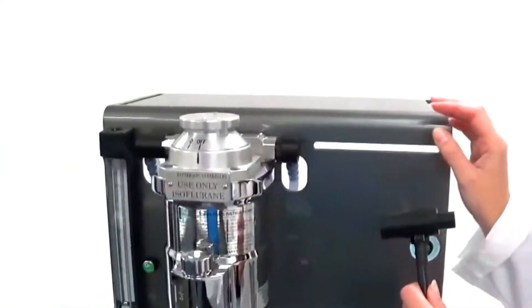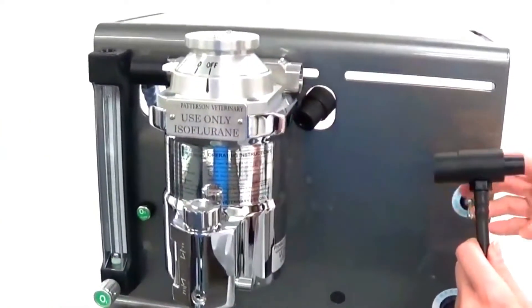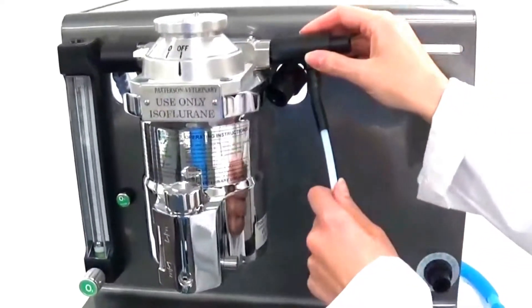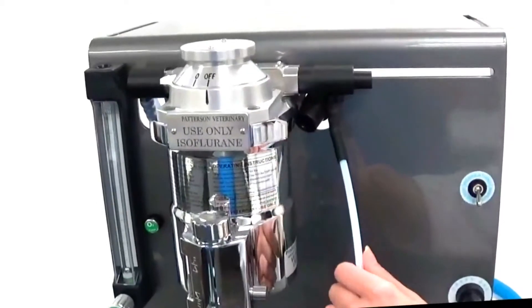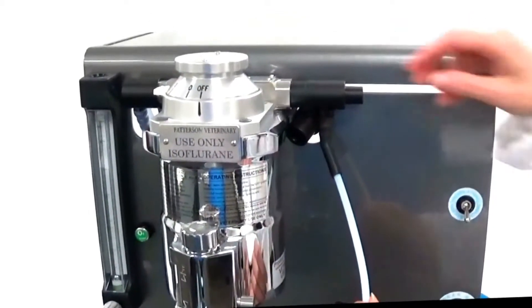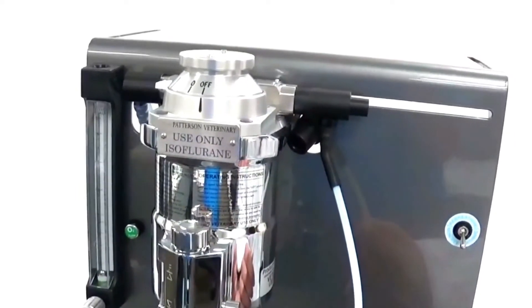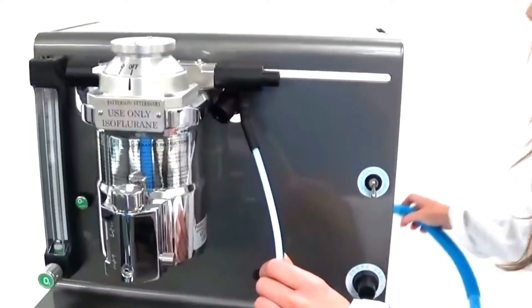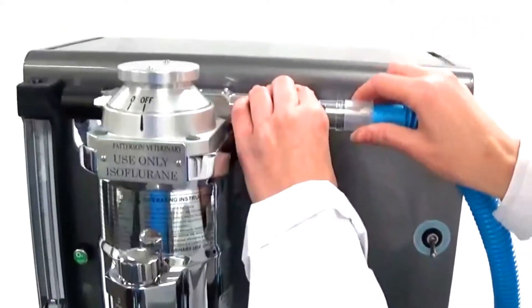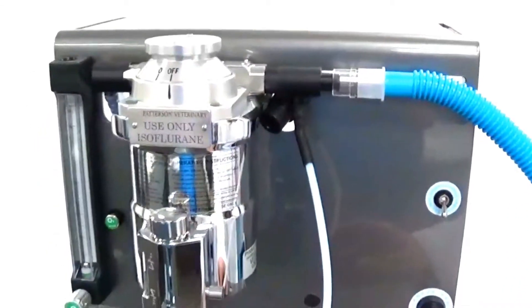Next, we need to remove the male end cap from the outlet side of the vaporizer and attach the gas sampling tee. Make sure the tee is snug inside the manifold to keep any anesthetic gases from escaping. Then we will attach the 19-millimeter tube to the 15-millimeter side of the gas sampling tee as shown.